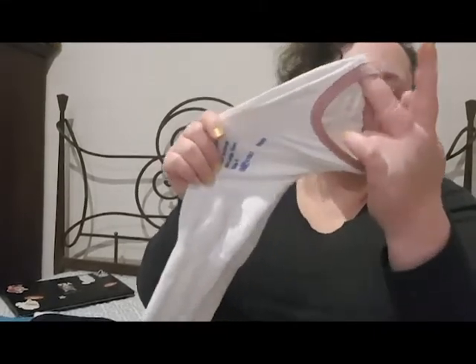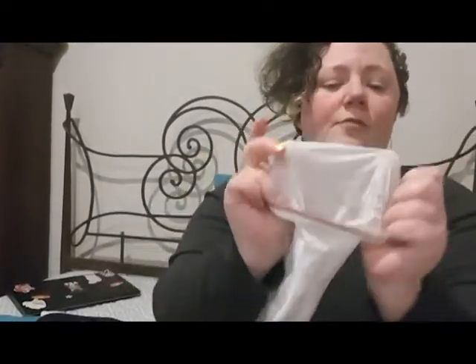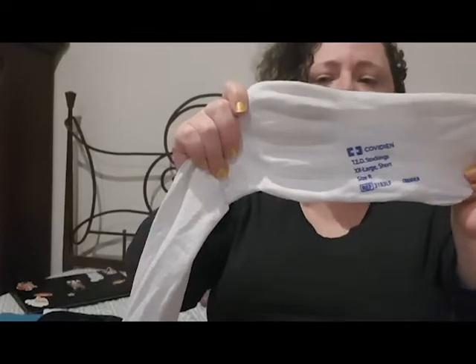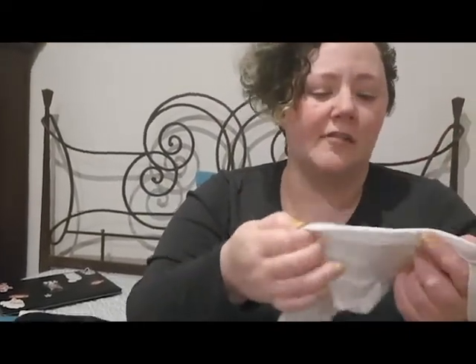I don't really think the open toe makes that much of a difference. I kind of like it because I've got really short legs, so it means that I can gently fold it back. And you'll see that there are these weird sort of bulges. This is a bit more obvious because I've worn this a fair bit and it has been washed a bit. That is for the heel. The heel, of course, sticks out a bit. It is actually a little bit thicker, but you can't really see it on the camera. You've got to search for it and know that it's there. That's just to go under the heel of the foot so that it doesn't wear out as quickly.